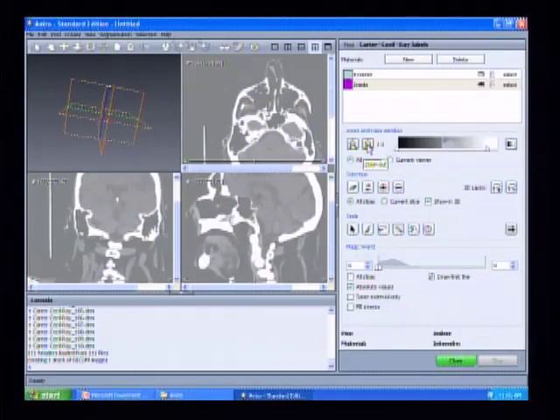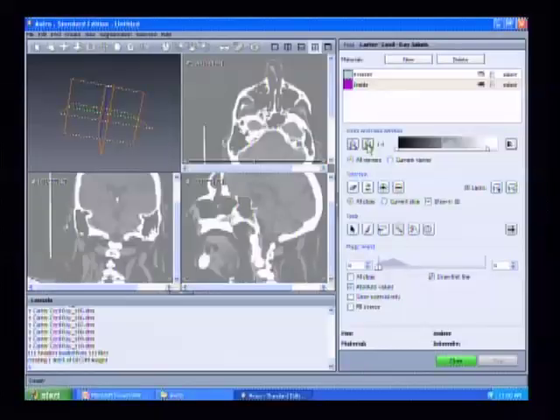So is everyone here? If you start at page 4 of your instruction sheet, it starts there and gives you a basic overview of this segmentation editor. You can tell that the entire user interface of Aviso has now changed. So you still have this 3D viewer, and it's split into the 3 views, and then also gives you where each slice is in the top left-hand corner.